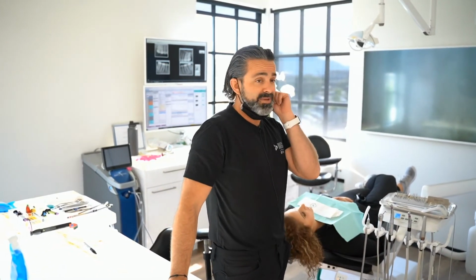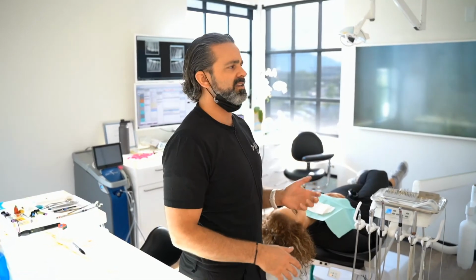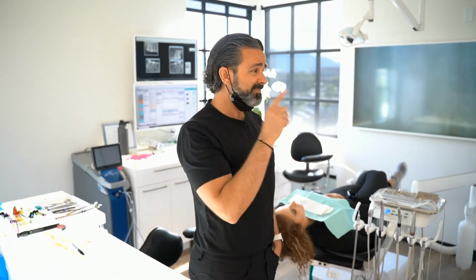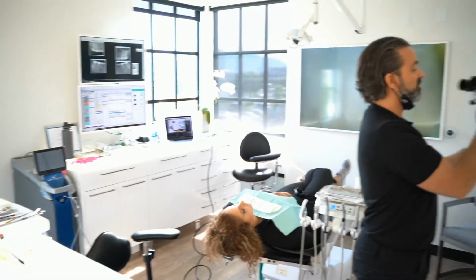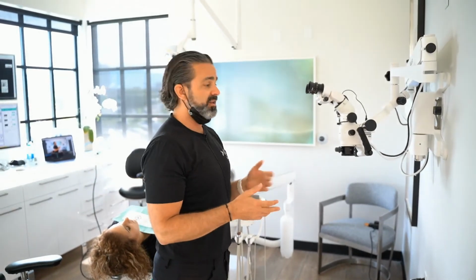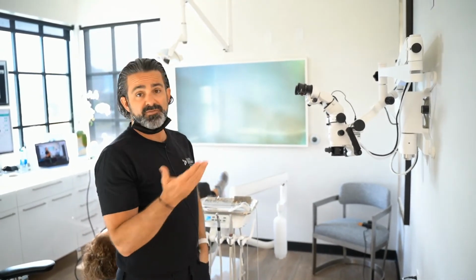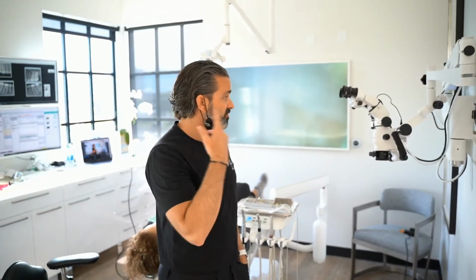For a seasoned loop wearer, my biggest thing is going to be your posture correction. First thing is you're used to tucking your chin down, and looking straight ahead is going to be fantastic for your neck, but that little push-pull is going to affect how wide you want this thing. If you're a forward leaner, you don't want this length. Go shorter.